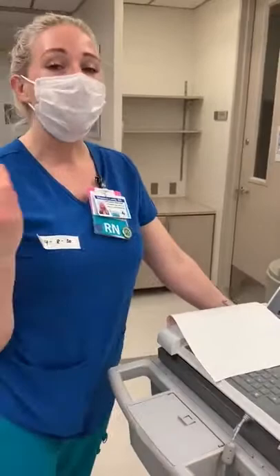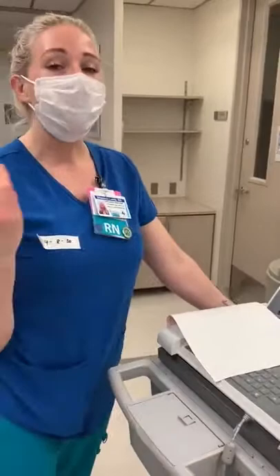That is your last step. It will take the ECG, put it into Epic so that whenever doctors come by and want to see it, it will be available to them. And if someone runs off with your beautiful printout, it doesn't matter because you have a nice electronic copy. That's it, guys — I hope that helps, and have fun doing all the 12-leads.